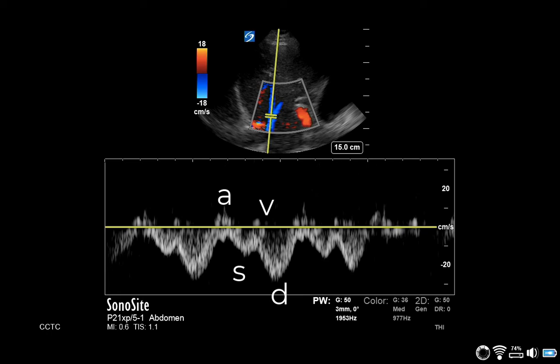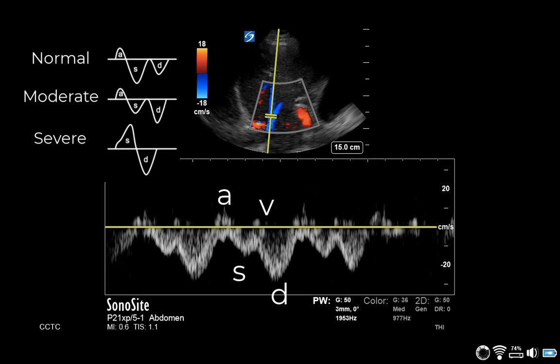In a normal hepatic vein tracing, there is first a positive A wave, followed by a deeply negative S wave, and a smaller negatively deflected D wave.